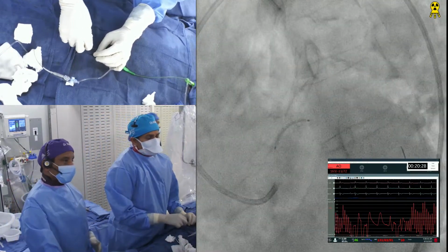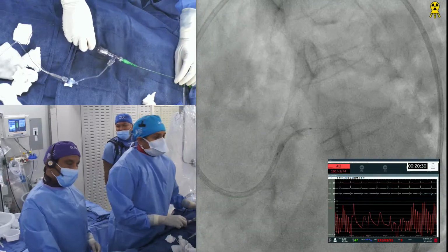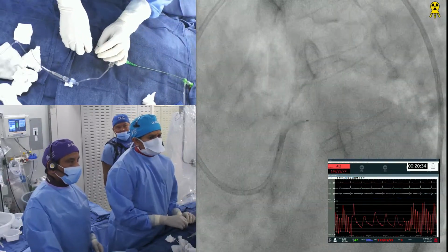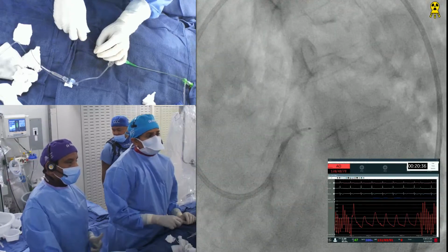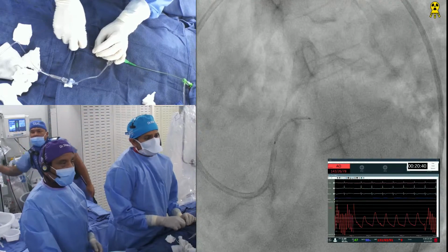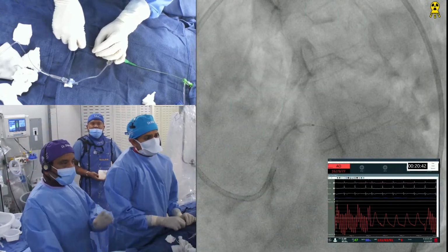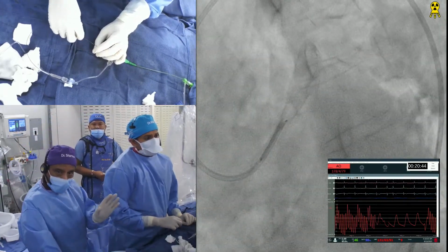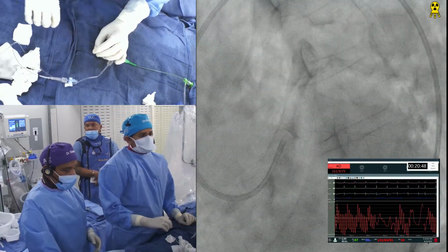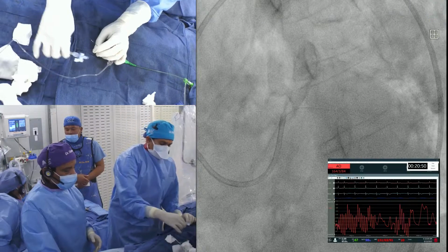Synergy will go in a nanosecond. No, I think there's a nodule. I don't know, but it allowed you to have done the good balloon. It's the same even with the rota in the beginning. Synergy and guideliner, both things should be there. So I think this is a good test for the 3.5 by 16 Synergy. Otherwise, we have the guideliner anyway. So the guideliner, we have to bring it down, which will be simple.